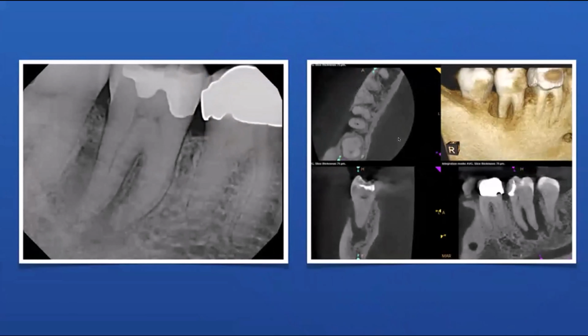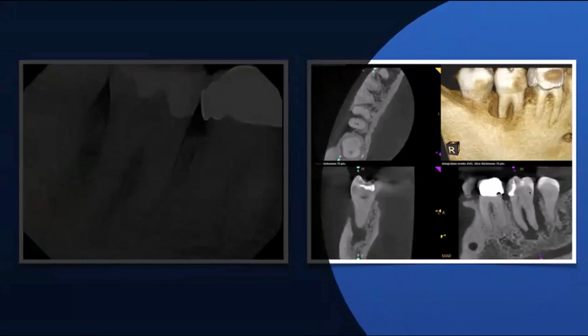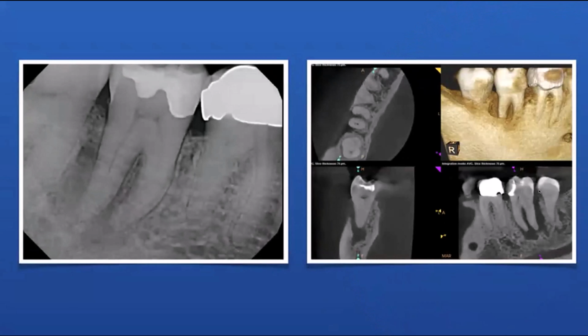Another example, again, significant vertical defect, but again, just a necrotic pulp that's aggressively spitting out bacteria and creating a strong immune reaction. And when I first started using cone beam, unfortunately, my lack of understanding is you see these cases and you think that you can't grow back the bone, and we never saw endodontic infections this way three-dimensionally. We saw them in a 2D image. So when we started to see how vast and large they were, it made us hesitant to sometimes treat teeth like this, let alone in one visit.